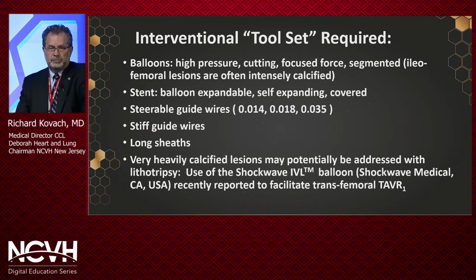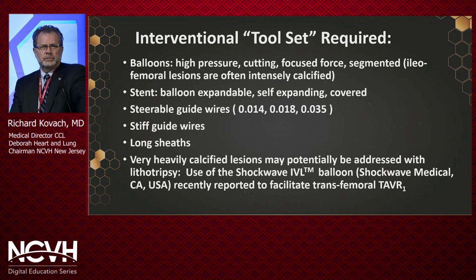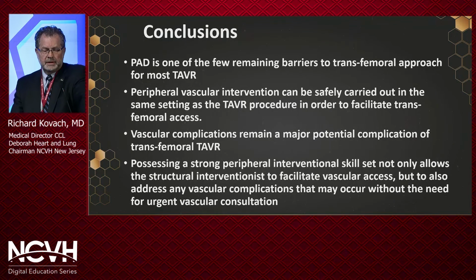So I think it's important to understand that whether you're doing coronary intervention or structural heart intervention, it's important to have the tool set on standby that you'll need to take care of your vascular complications.